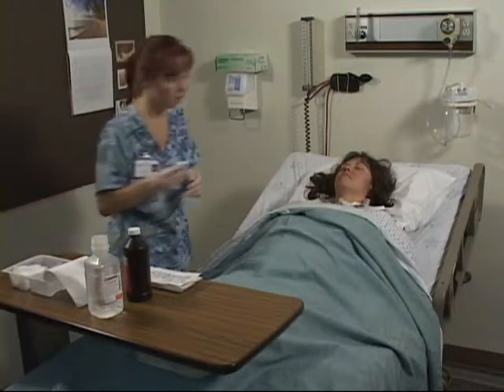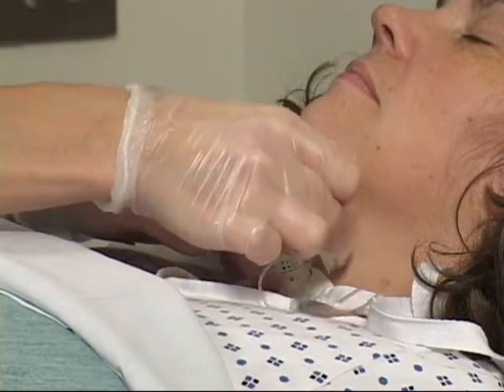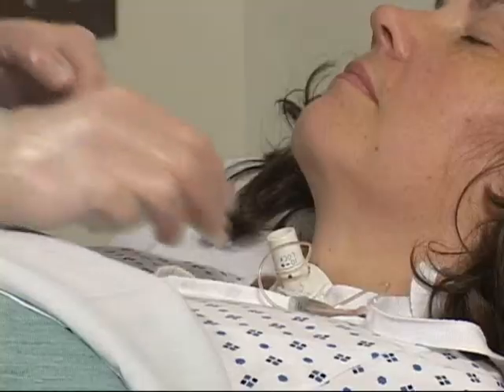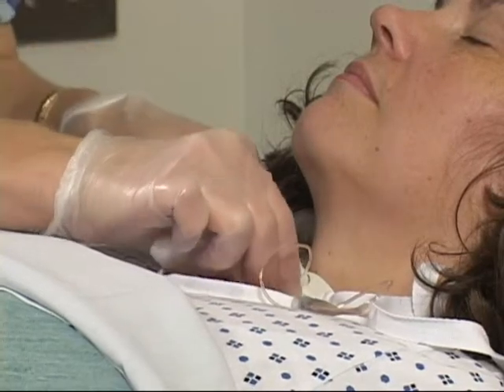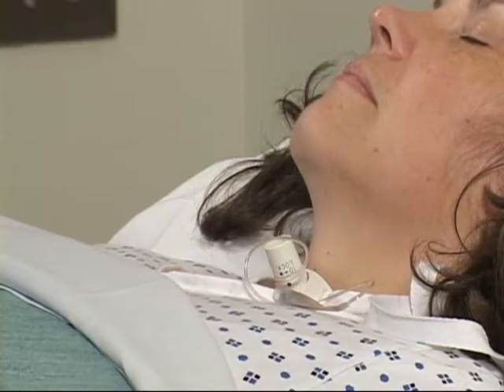Wipe only once with each pad and discard it in order to prevent contamination of a clean area with a soiled pad. Repeat the same cleansing procedure under the neck plate, on the skin of the client. Be sure to use cotton applicators to dry the skin under the neck plate to prevent skin irritation or breakdown.